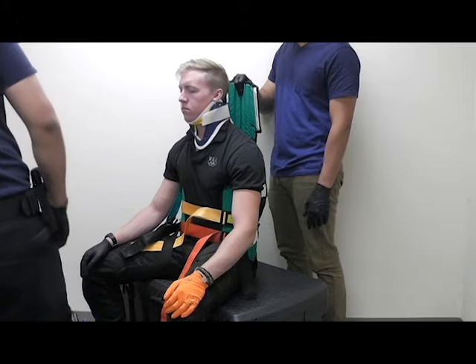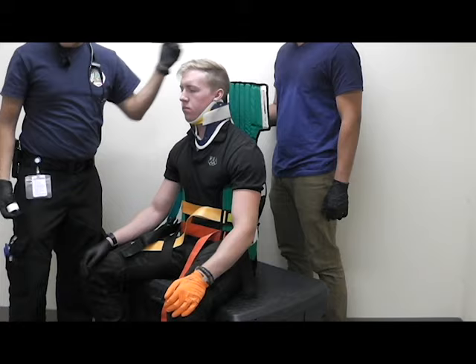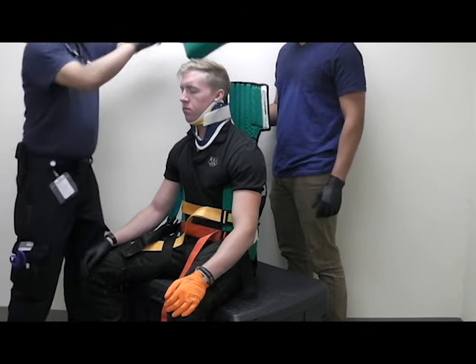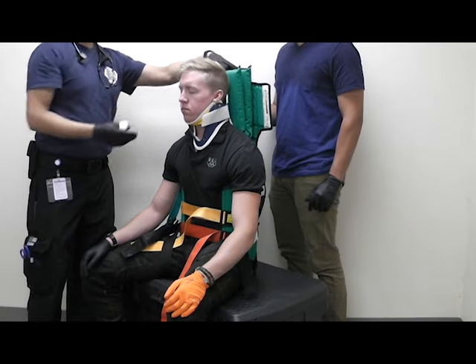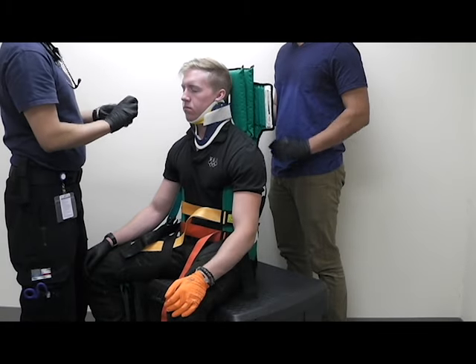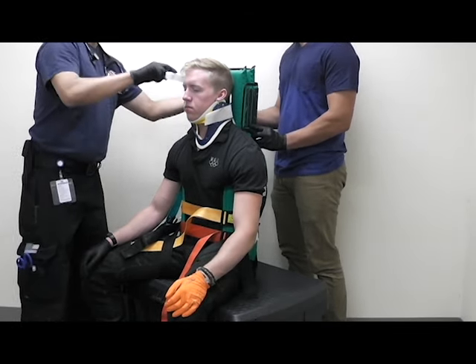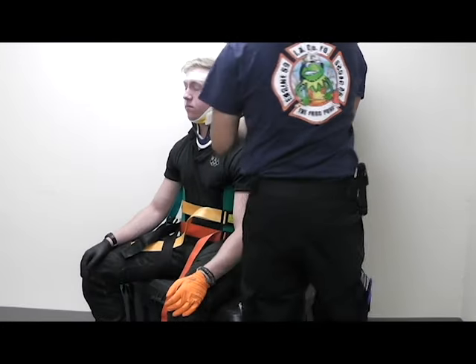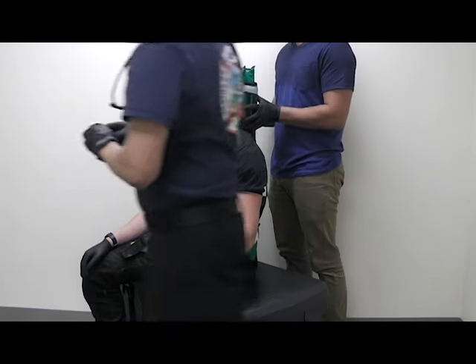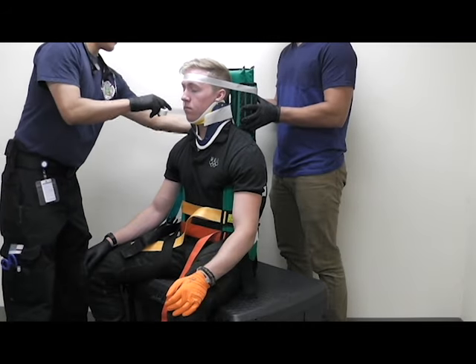At that point you're going to move on to the head. In this case we have a little bit of space behind the patient's head, so we can use the padding — take it, place it — and that way the patient's neck is further supported. Then go across the patient's forehead, and then here's the chin strap.